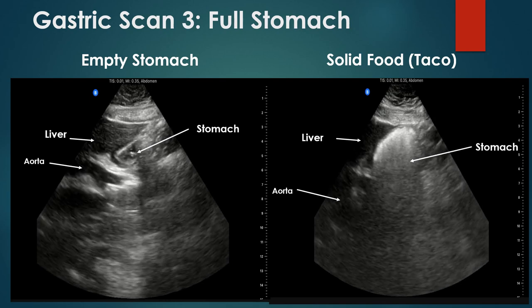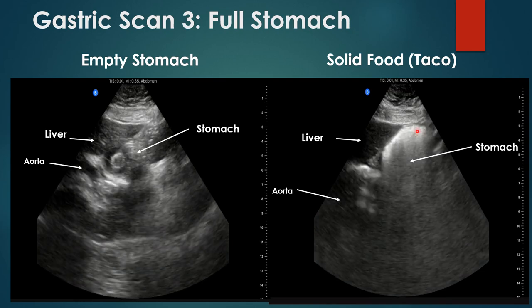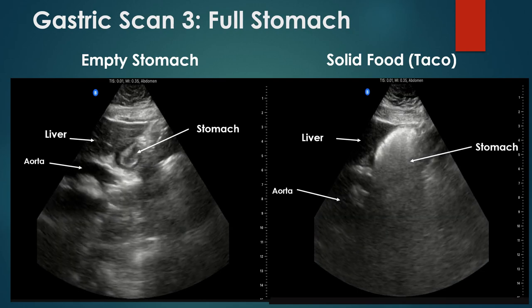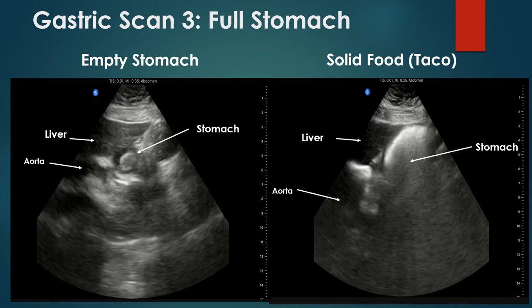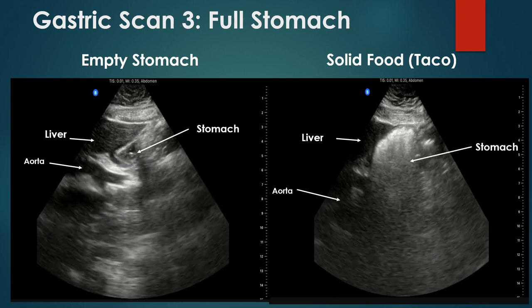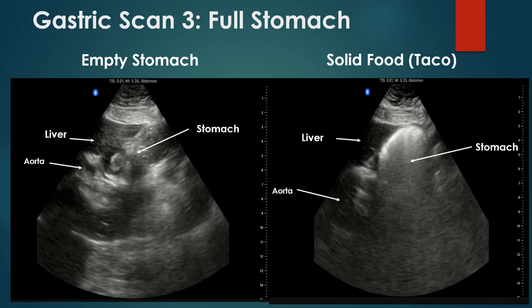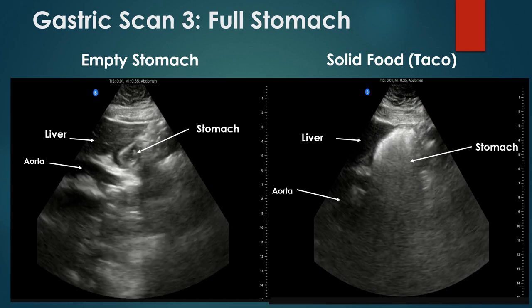Here's the aorta over here, which is kind of poorly delineated. And you can see the frosted glass appearance here, and you think, well, that's not very good at all. You have to be very careful looking at bowel here and stomach over here. That can be easily confused, and then your decision making is completely flawed. So a lot of this has to do with lining up your aorta and everything in the correct plane.